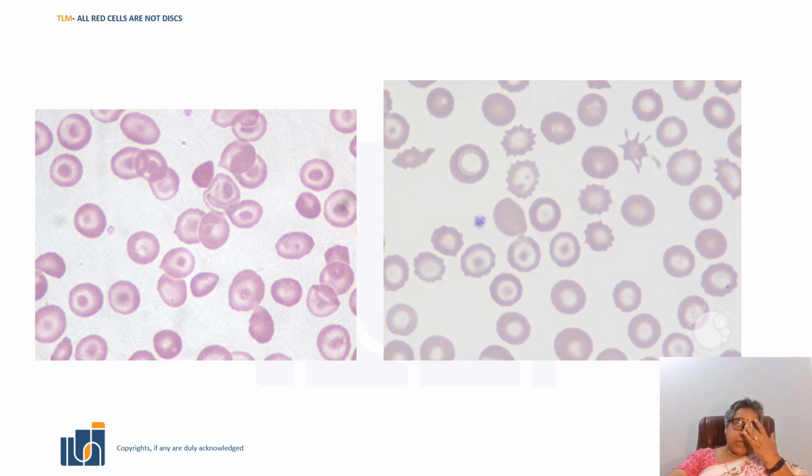So when it is hematological, red cell related, you'll have normocytic and microcytic targets because you can see microcytic cells, you can see some spherocyte, whereas this is due to liver disease. So when you look at the smear, you have to look at the shape, you have to look at the size, you have to look at the distribution, you have to look whether they are in the same direction, whether they are multidirectional. All these things one needs to keep in the mind.